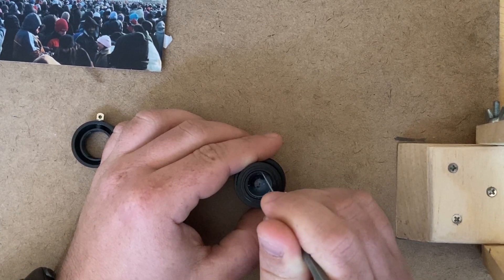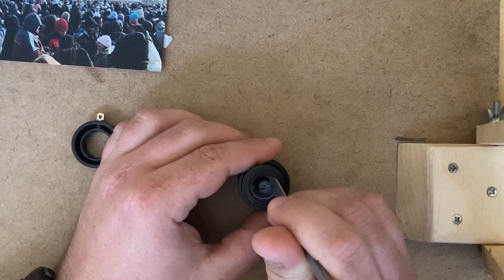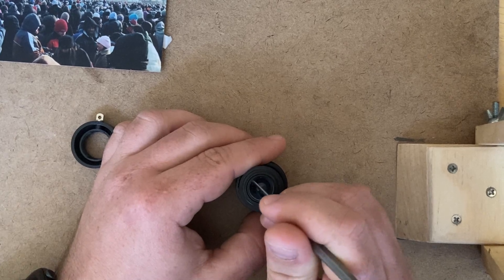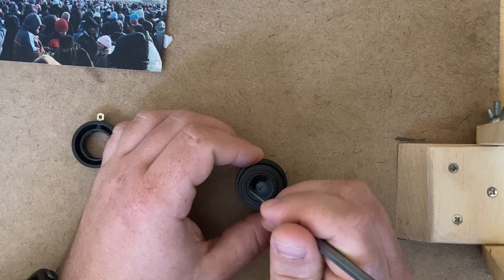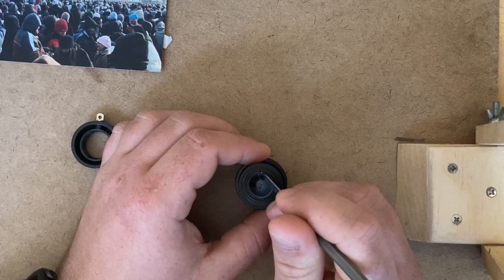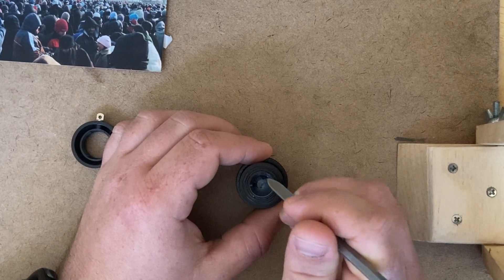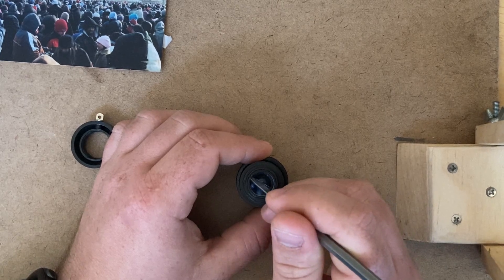The way a monocular works is light comes in as parallel rays in through the objective lens, which bends it to a focal point just in front of the eyepiece lens. And then the eyepiece lens straightens everything out before it gets into your eye. So what you see is a magnified distance image.